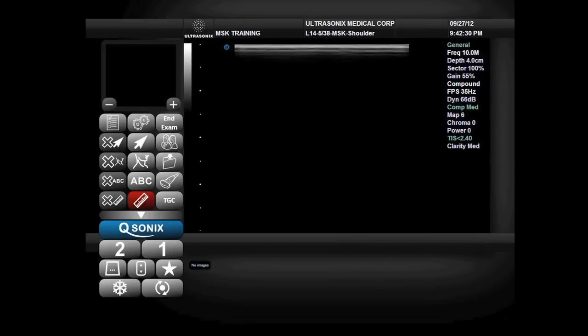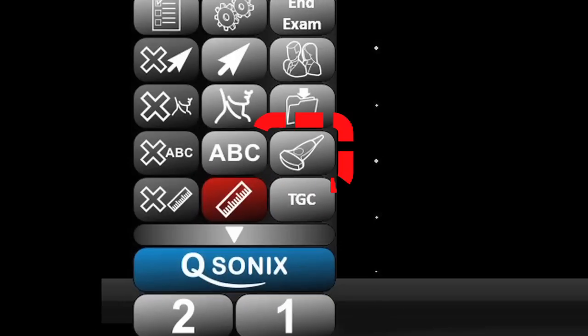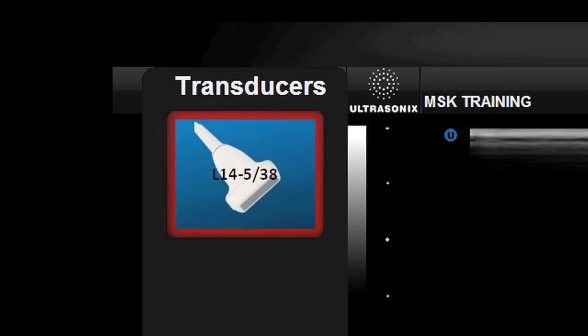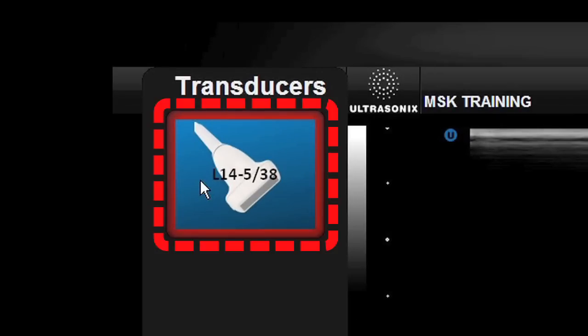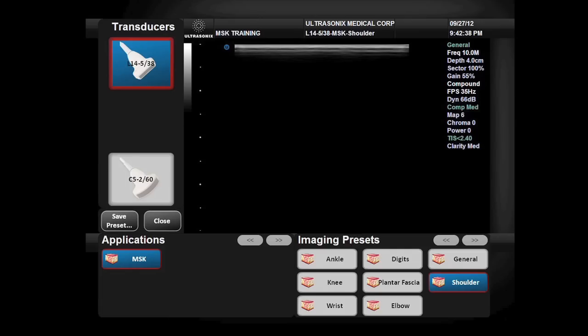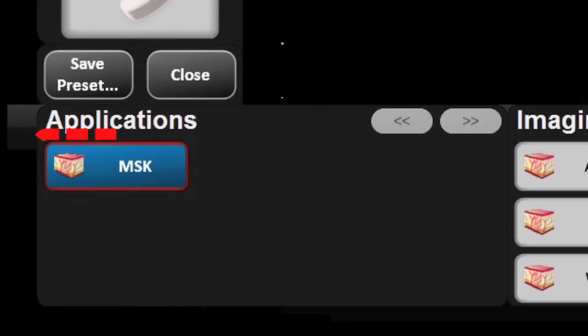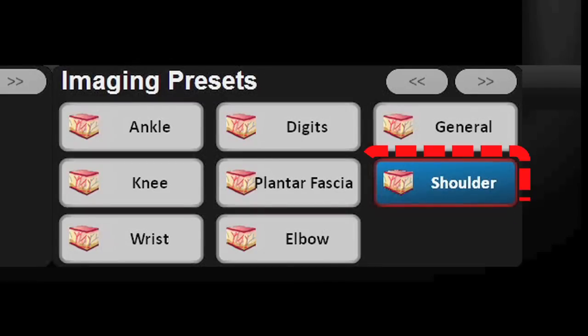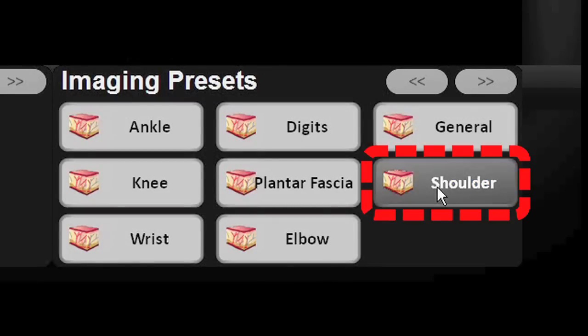To set up the appropriate parameters for the shoulder examination, I'm going to first select the correct probe. I will select the L14-5 linear array probe, the musculoskeletal application, and the shoulder preset.